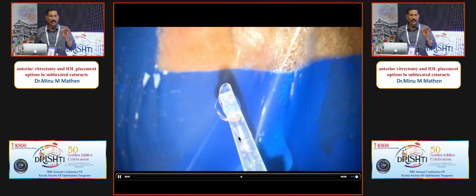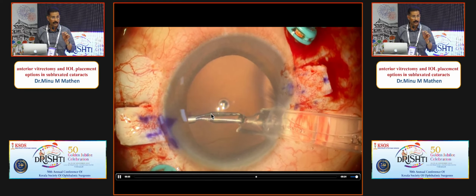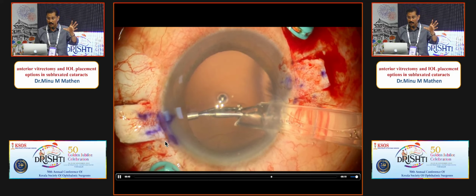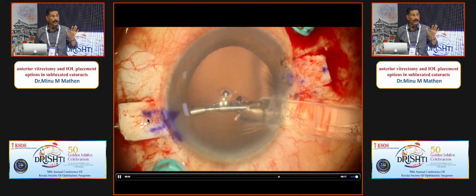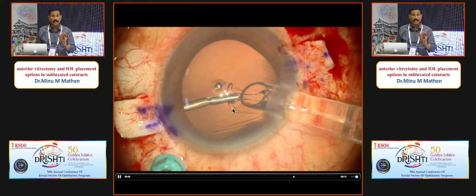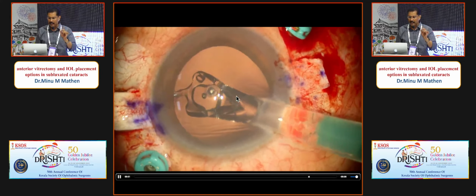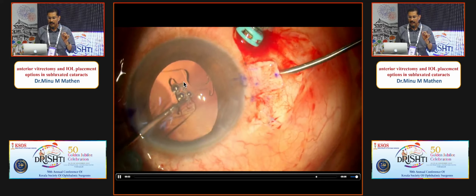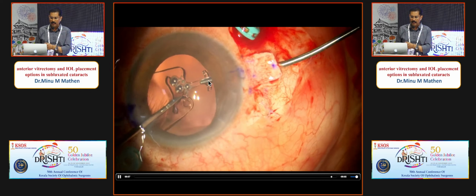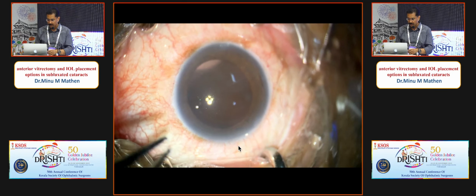Here the difference is that the incision has to be slightly away from the center because holding it will be easier, and the flap size is larger, 3 millimeter by 4 millimeters, so that the tip gets nicely buried there. And once the tip has to be held, the center, not the edges, it has to be held at the T tip. Once it is held strong, inject completely, and then retract this. I will show you in the other video. And the next side also, hold at the junction and exteriorize it. And this was not there in that video, and that's why.